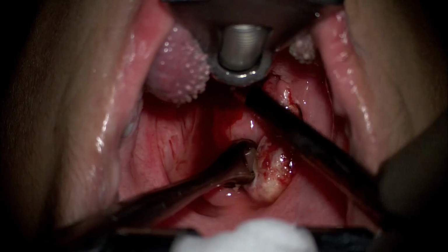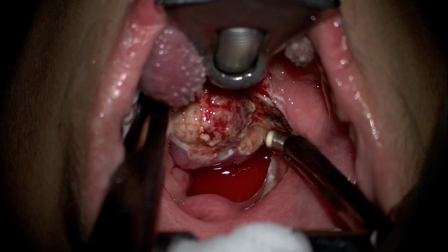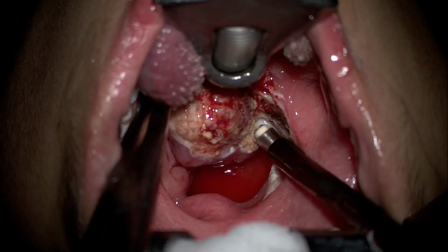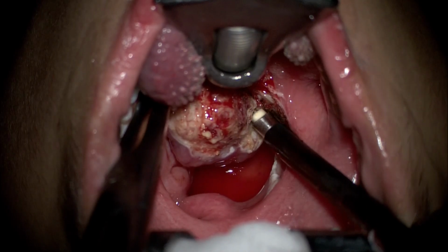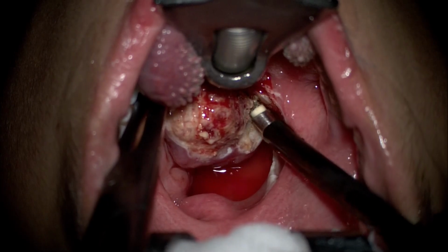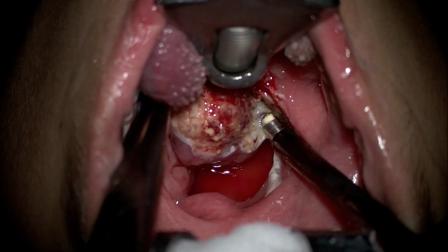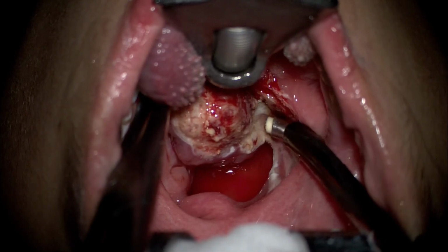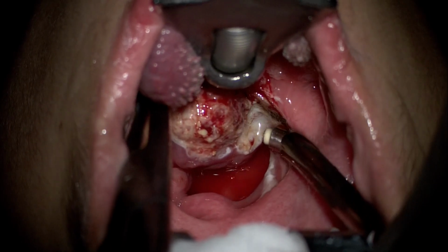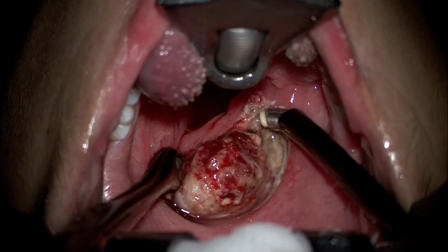As we keep going inferiorly, this is a large tonsil, as you can see, and inferiorly we would encounter the junction of the palatine tonsil with the lingual tonsil, and one must differentiate that and not go inside the lingual tonsil because that will cause unnecessary excessive pain. Here, as you can see, since there was a slight amount of bleeding, we have resorted to more gentle brushes with the coblation device and not going too aggressively, and again going onto the medial aspect of the tonsil and not damaging or ablating the musculature in the tonsillar bed.